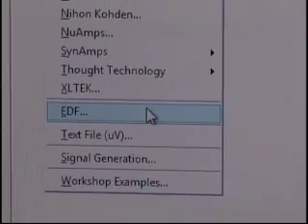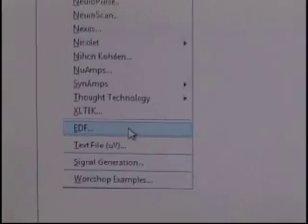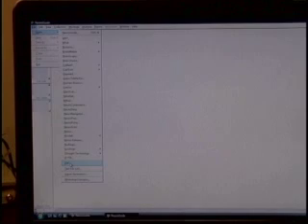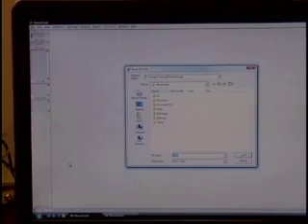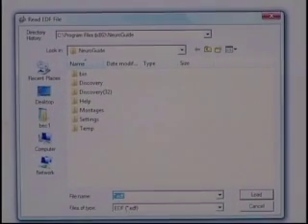Whenever you're reading the basic Discovery files, which are written by the Brain Master software, NeuroGuide is going to read in an EDF file. So I've chosen File, Open, EDF, and now I have the NeuroGuide file browser.